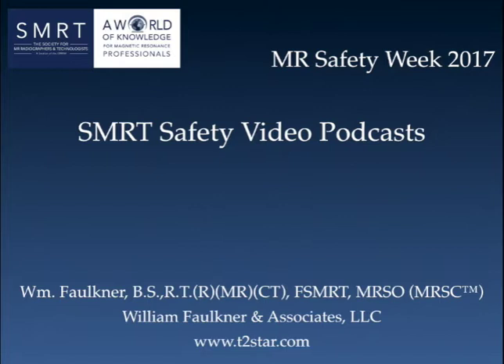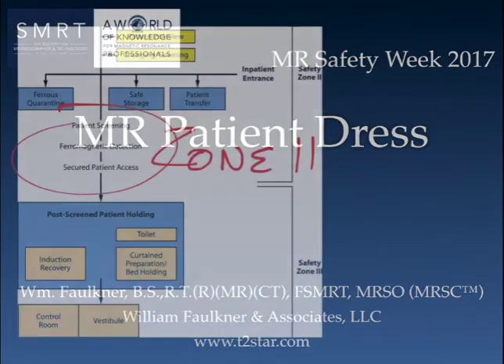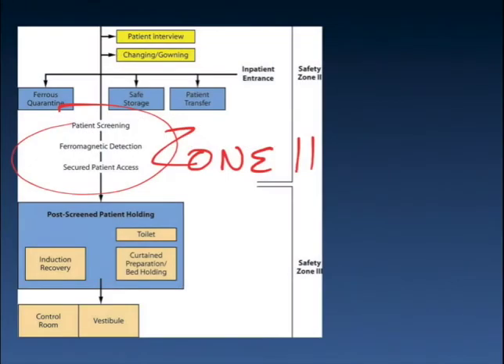In this video podcast, we're going to take a look at the importance of MR patient dress. Now, again, remember, screening and dressing, changing patients should be done in Zone 2 before the patient enters the MRI environment.